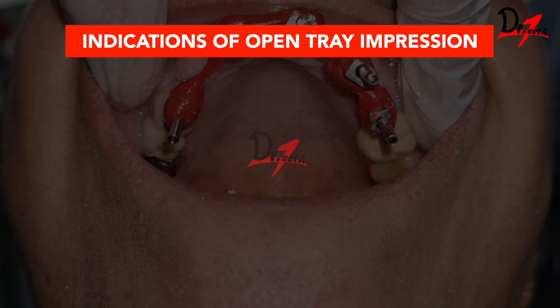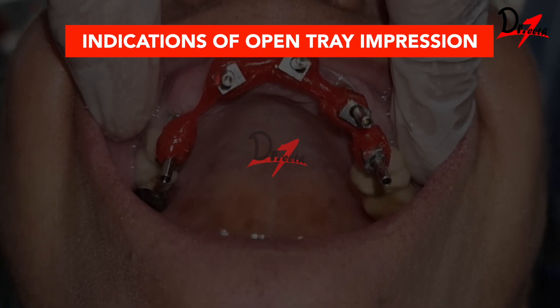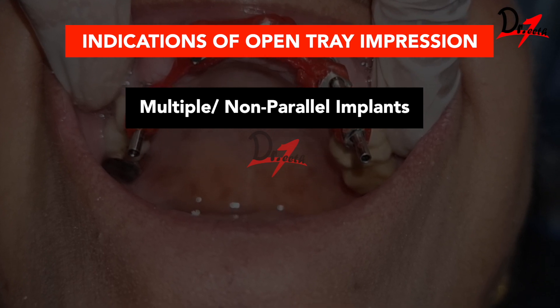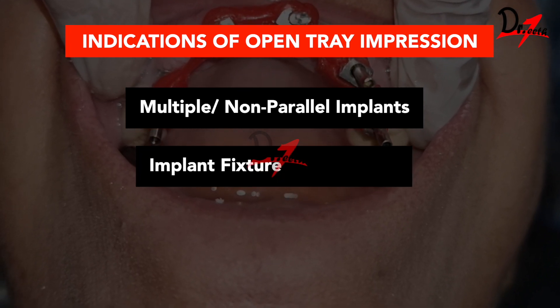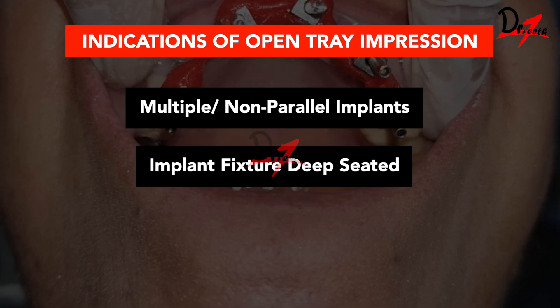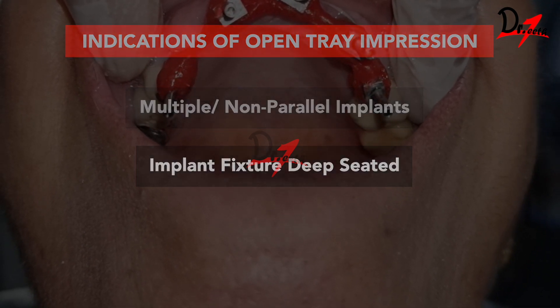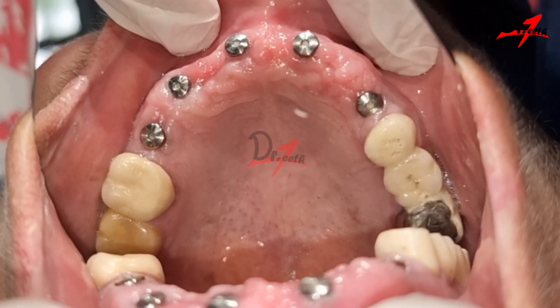The first indication, as already mentioned, is multiple implants, especially if they are non-parallel implants. Also, if the implant fixture is deep seated within the soft tissue, this method is indicated.